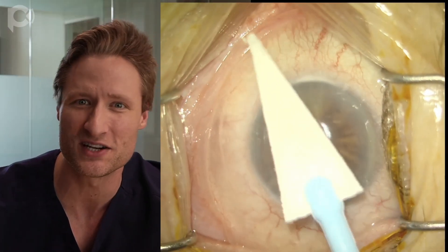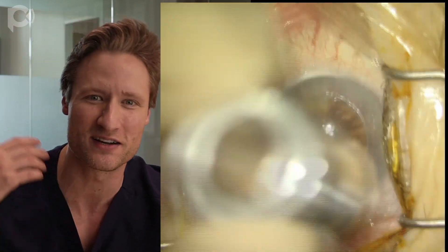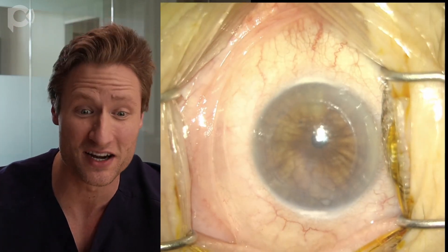The video we're going to use for explanation is an old video from the archives. This was a case I was doing six or seven years ago, when I was not that far into doing DMEK myself. This shows all of the training wheels we used to use to do the operation. The ideal patient selection is probably a 50 or 60-year-old pseudophakic patient who maybe has Fuchs dystrophy, so the anatomy of the eye is not too complicated.